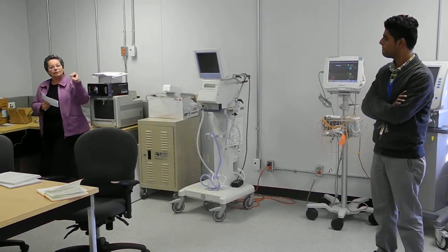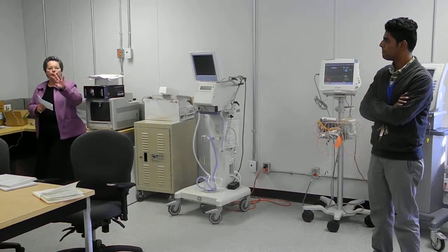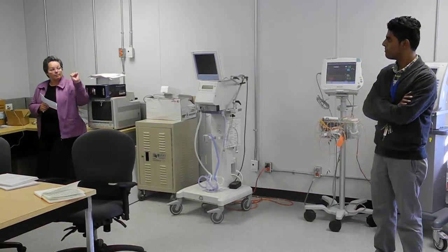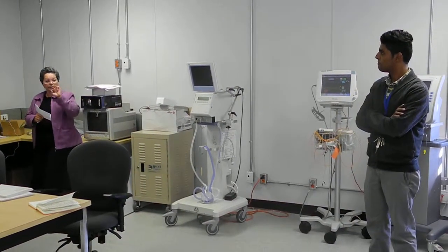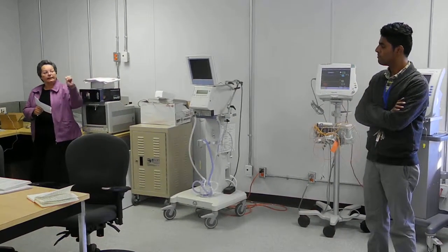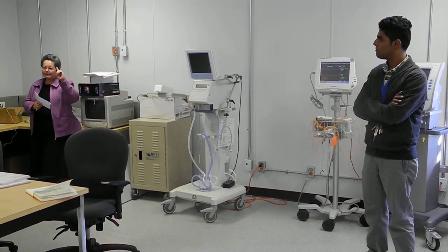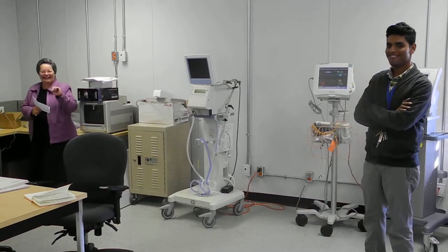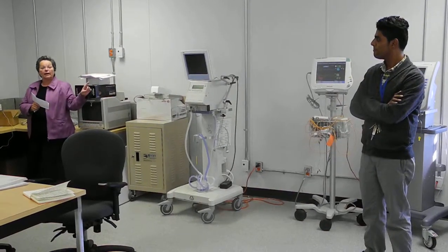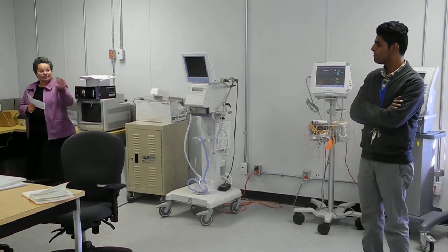And in the hospital, they get read, if you're lucky, every 20 minutes. And they take 3 readings from all of that. So everything else gets thrown away. And by using algorithms that Carolyn and her team have been building on the full database, they now are able to identify the onset of neonatal sepsis 72 hours before they were diagnosing it in the hospital using the face-to-face 20 minutes.